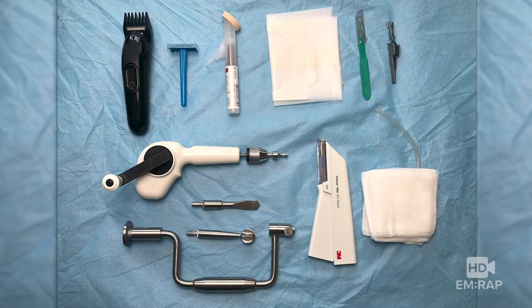Let's start with the equipment. You'll need hair trimmers or a razor, skin prep, a sterile drape, a scalpel, a self-retaining scalp retractor, your trephination device — shown here is a hand drill and also a Hudson brace, which is how this procedure will be demonstrated — a skin stapler, drain, and gauze.